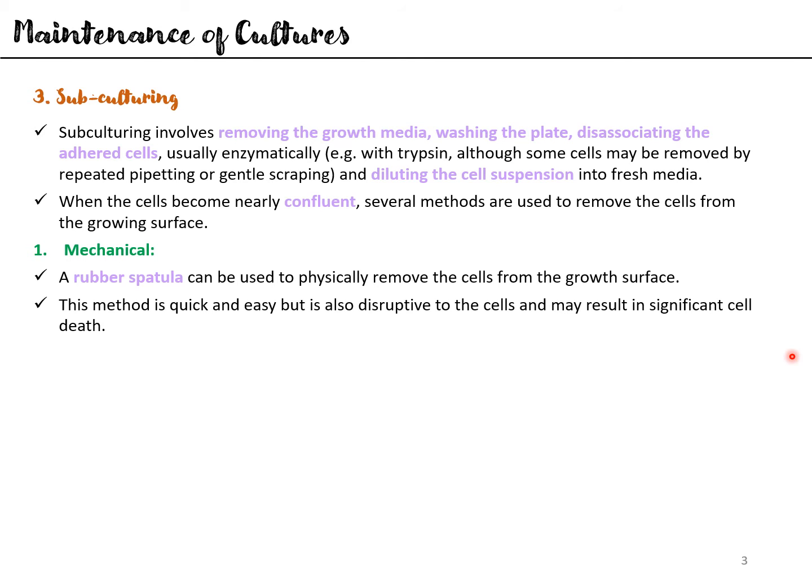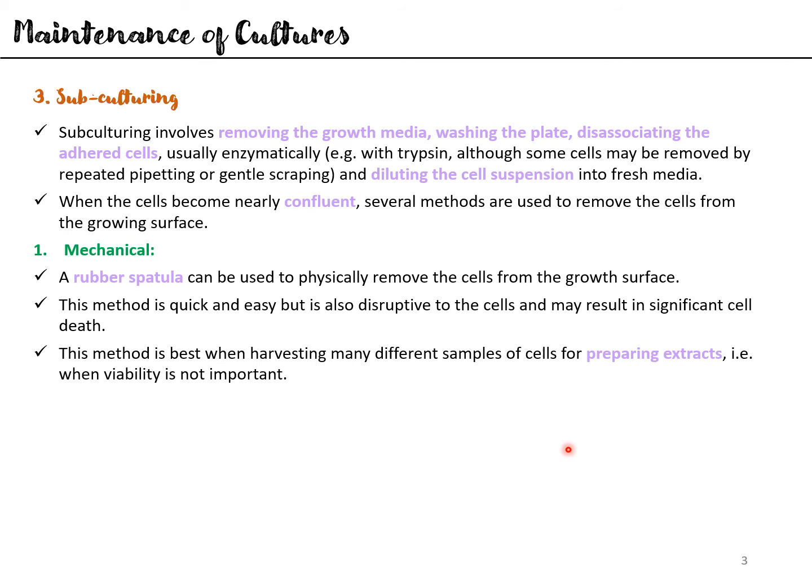This method is quick and easy, but it is also disruptive to the cells and may result in significant cell death. This method is best suited when you're harvesting many different samples of cells for preparing extracts. That is, when viability is no longer important.